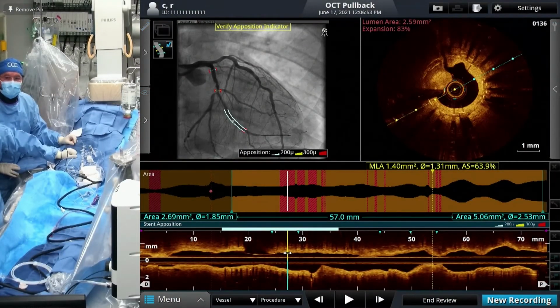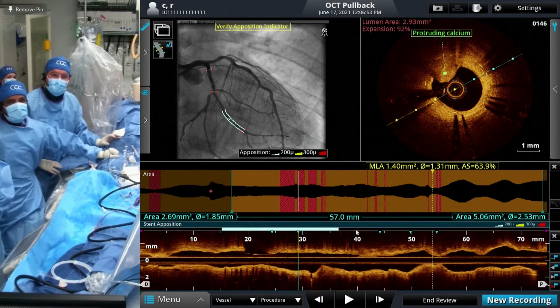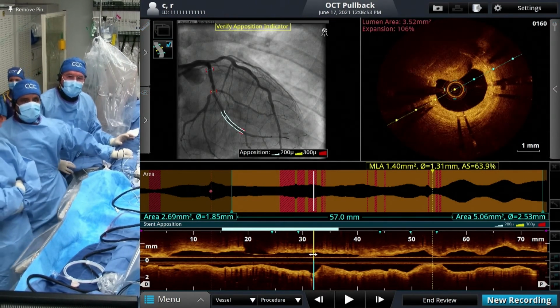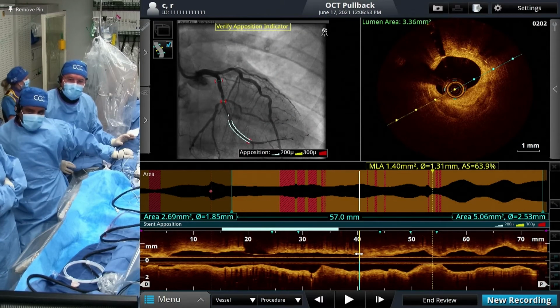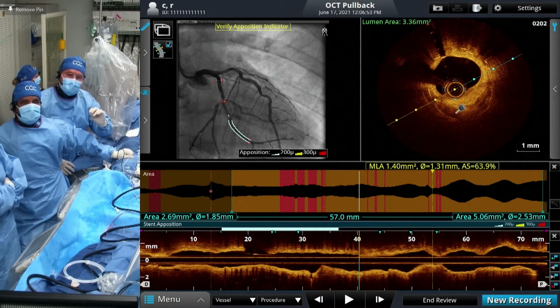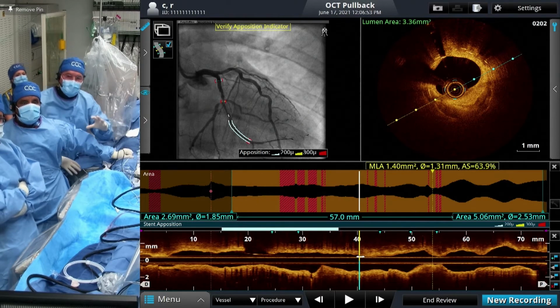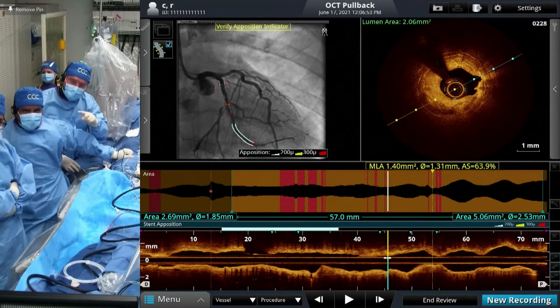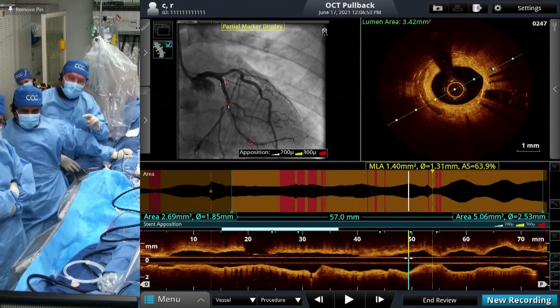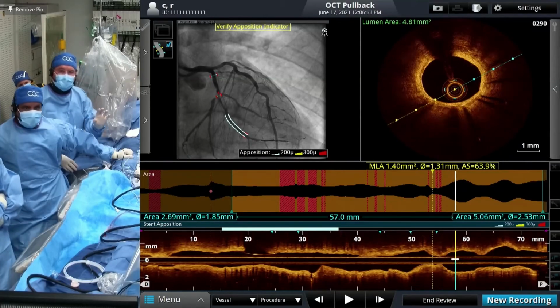And then there is an area where you have a nodule, an ISR with a big nodule of neointimal hyperplasia. Just go proximal on this, and then you see the calcium. So over here is neoatherosclerosis, and that's calcium. See, the refringency is very direct. You can see behind. So that's not lipid. If it was lipid, you wouldn't see anything behind. So here is a lot of calcium in this ISR. A 360-degree calcium there with the double layer, and more proximally you see neointima and a little bit more severe neointimal hyperplasia. So we have trouble with this case.